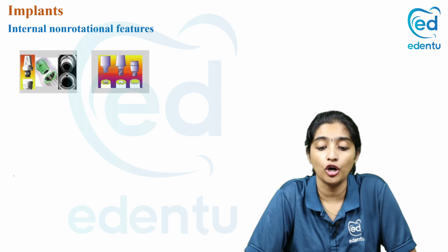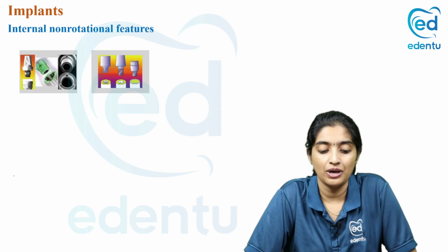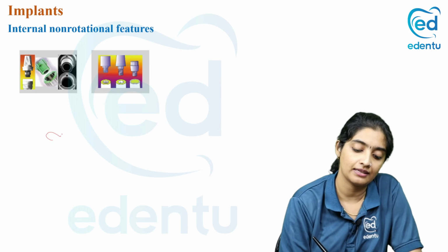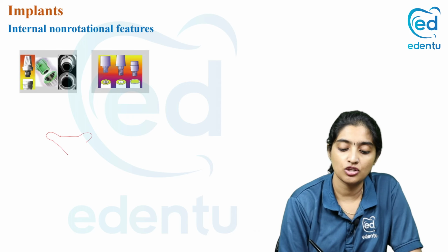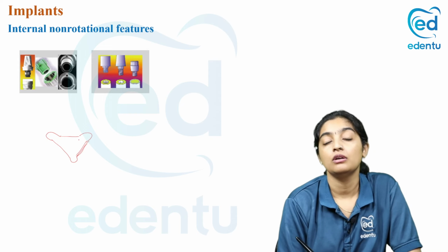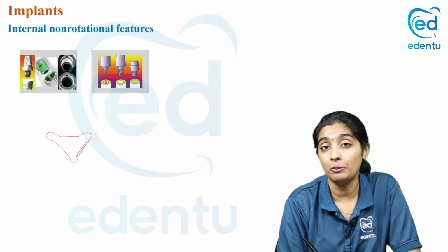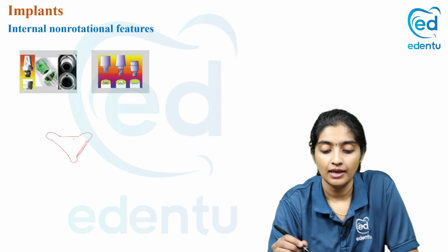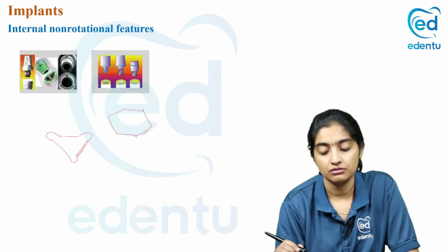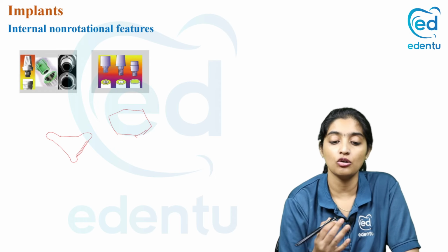Coming to internal non-rotational features, this is very common, you have something like this. It's called the Mickey, most commonly seen for Nobel Biocare implants. Then you have hex like this, hexagonal. So these are all the non-rotational features.